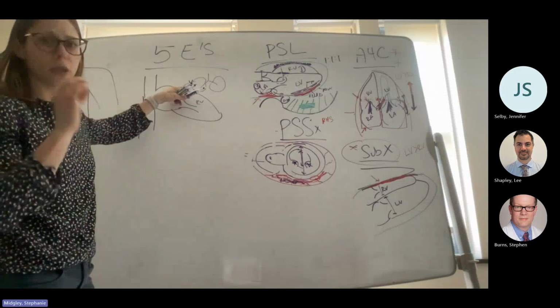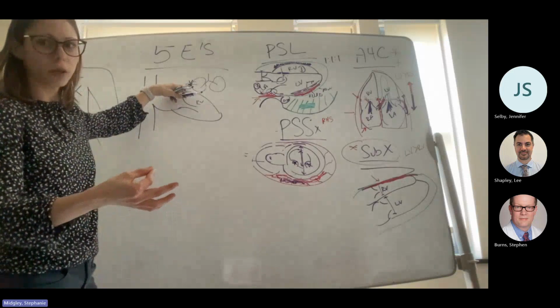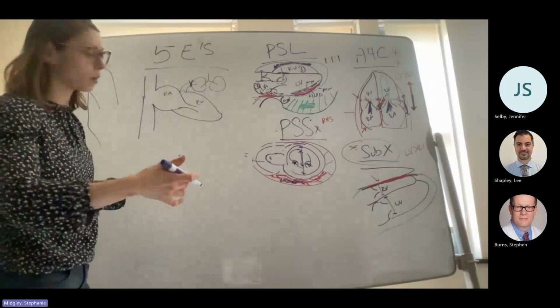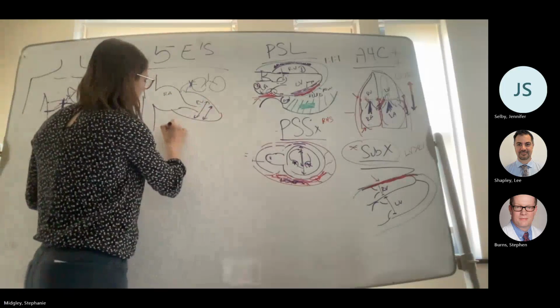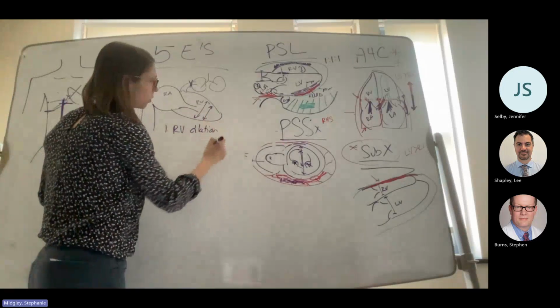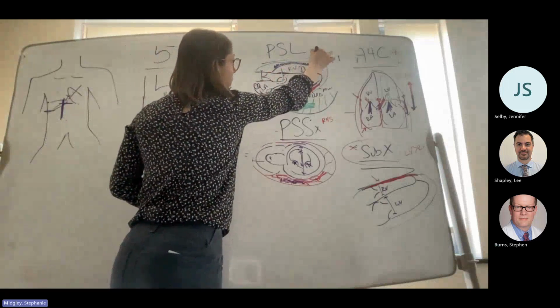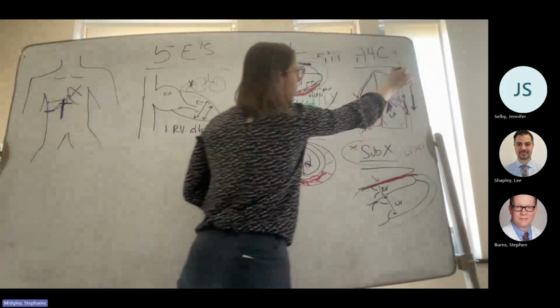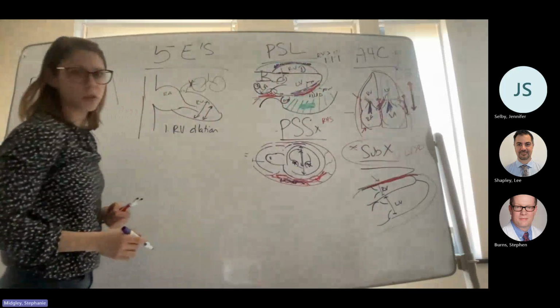The moment you take that balloon and now you pinch that neck closed, you put an obstruction in that artery, what happens to the RV? Or what happens to your balloon? Stays big, right? So the first thing you're going to see with right heart strain is RV dilation, which brings us to our equality, right? So our 1:1:1 ratio now becomes my RV gets big, and then everything else is 1:1. Or here, my RV gets bigger than my LV. That's the first thing that's going to clue you in.